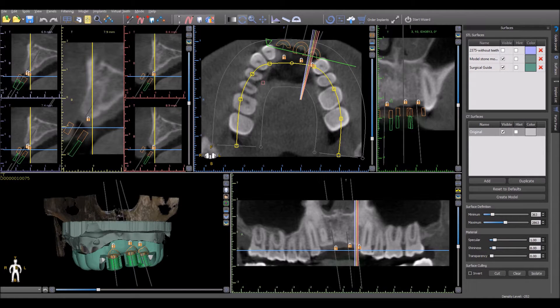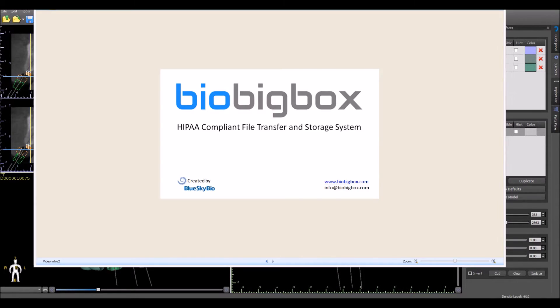Blue Sky Plan treatment plans can now be sent to anybody with an email address directly from within Blue Sky Plan. The treatment plans are often 30 megabytes or larger, meaning that they can't be sent using a standard email system. As such, Blue Sky Plan has integrated directly with BioBigBox, a HIPAA compliant file transfer and storage system.